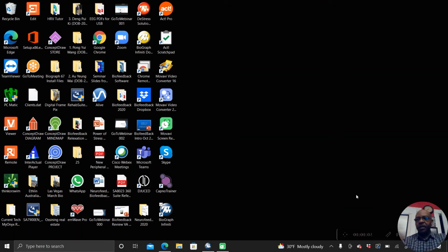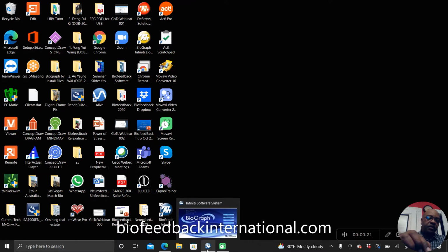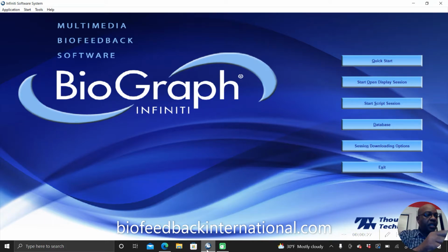Alright, here we go. We're going to try this recording using the MyoScan Z. This is what the MyoScan Z looks like. It is a different style EMG preamplifier. This one has the impedance testing built into it, just like the EEG Z has it, so we can test impedance when we're doing EEG sensors. It's not as commonly done where we test the impedance for EMG, but it can be just as important. So I'm going to just show how this would work.